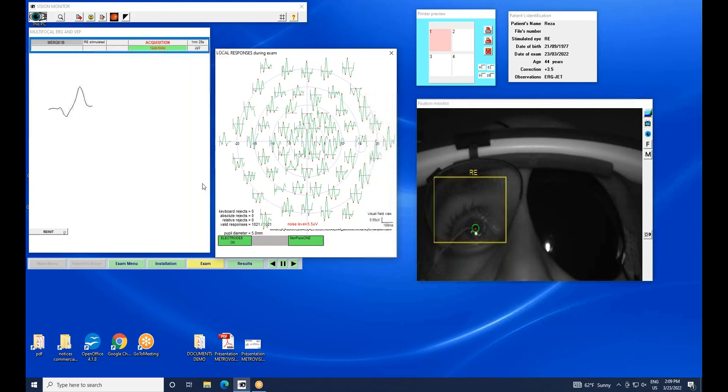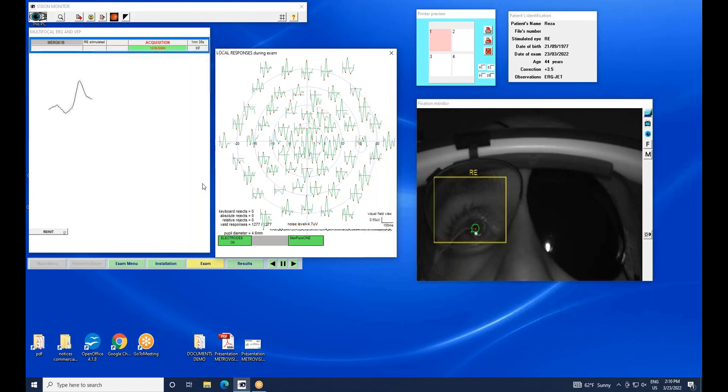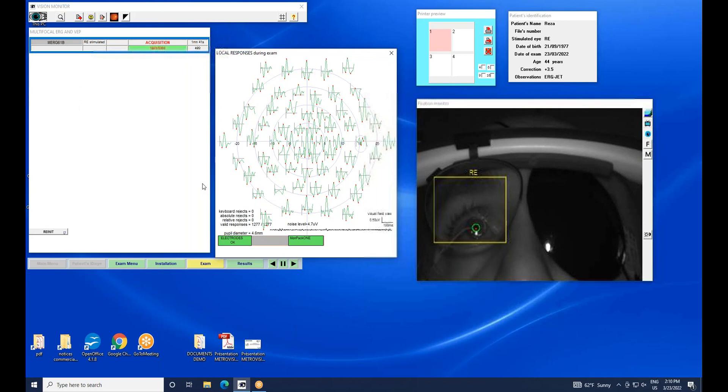Now it's in red color, indicating the noise level is still too high. This noise level is a good indication of the quality of the result. It should be as low as possible and it will normally improve as I get more responses.